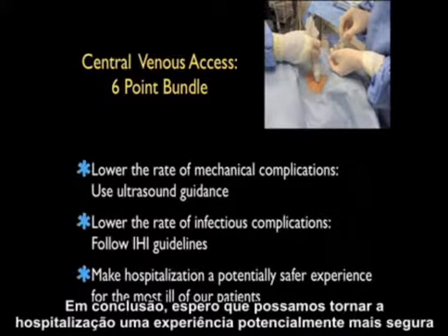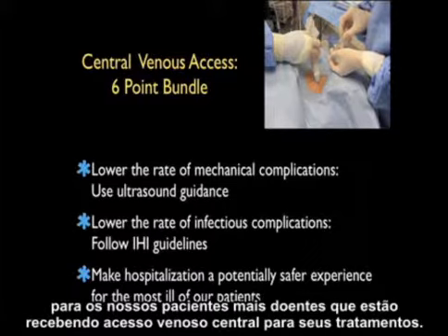In conclusion, hopefully we can make hospitalization a potentially safer experience for the most ill of our patients who are receiving central venous access for their treatments.